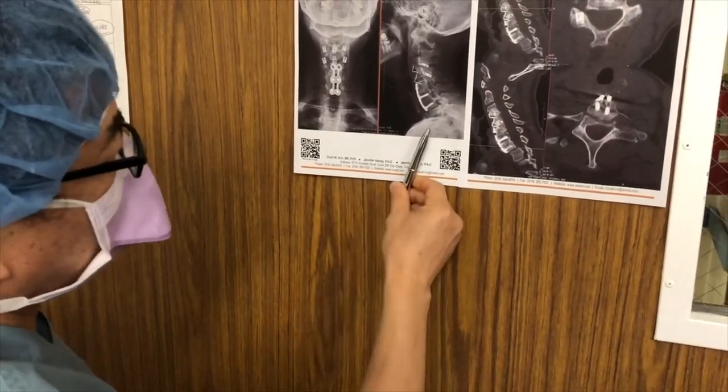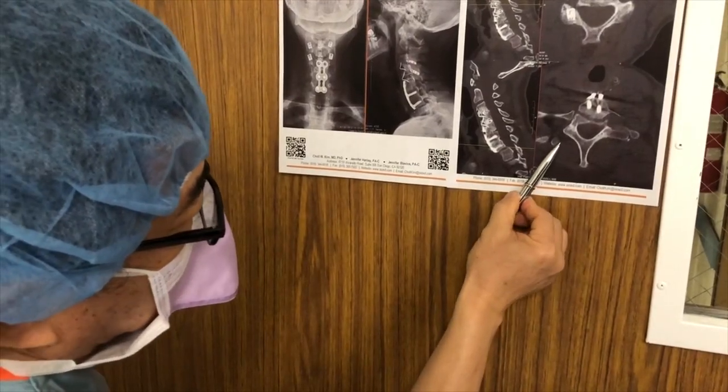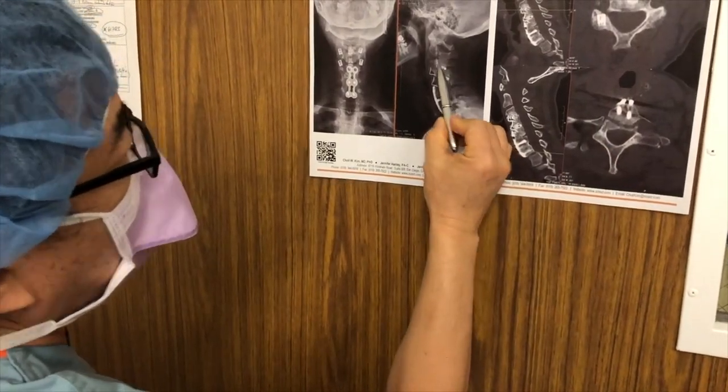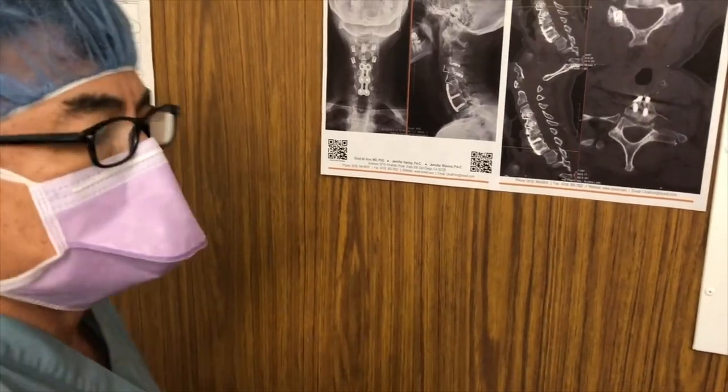I'll use computer navigation and I'll be able to put in, using the image guidance, a C7 pedicle screw to get really good fixation. And then I'll be able to put in screws into these little lateral masses, again, using image guidance. So I'm excited.